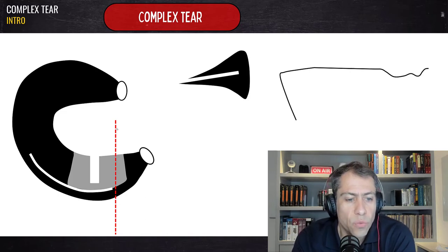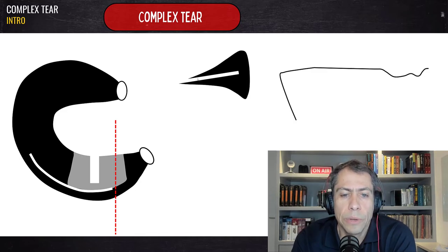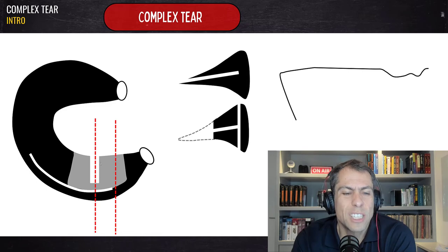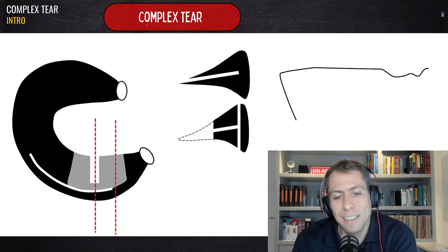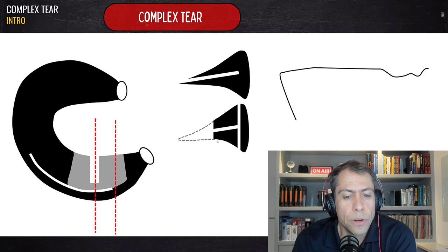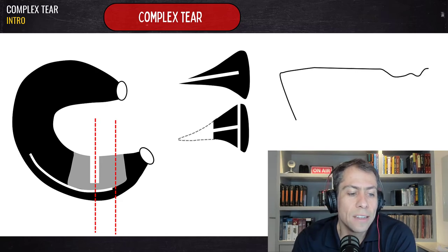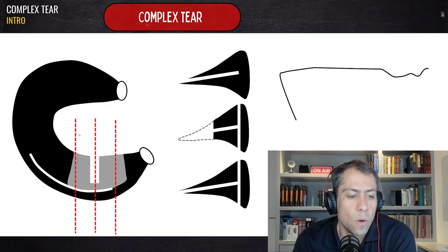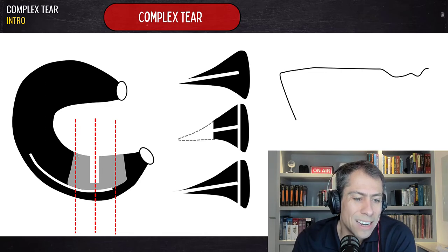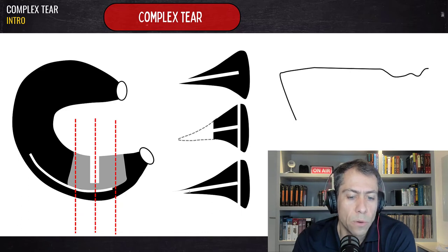In the first sagittal slice we can see the horizontal tear. In the second slice passing through the radial tear, we can see the partial radial tear, the horizontal tear, and the vertical longitudinal tear. In the last slice more laterally, we can identify two different components of this complex tear: the horizontal component and the vertical longitudinal component.